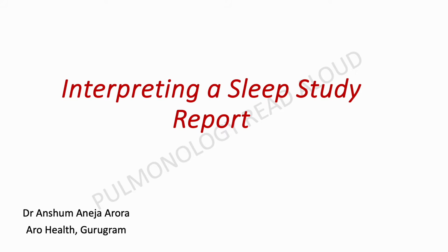Today, I'm going a little bit off the track and not reading aloud a published document, but actually reading aloud my presentation on interpretation of sleep study report. Interestingly, I presented this in a sleep workshop organized by the Indian Chest Society, and a lot of the PG residents attending there came to me and said, "Ma'am, why don't you have it on your channel?" So here it is for those who missed it out, and I hope it helps you in your practice.